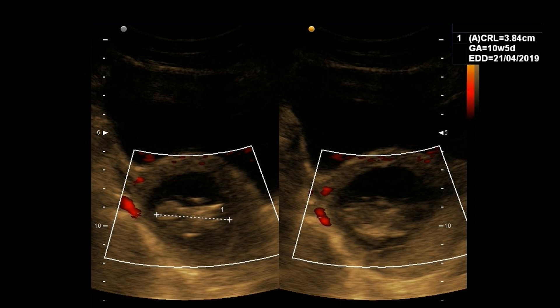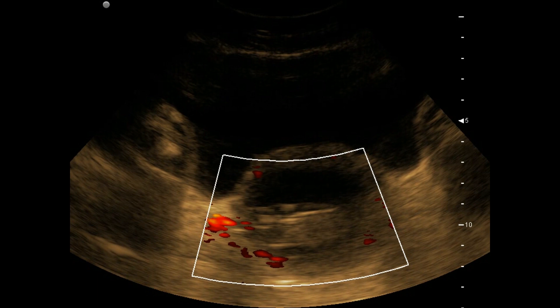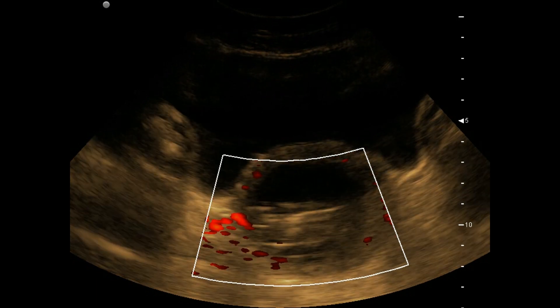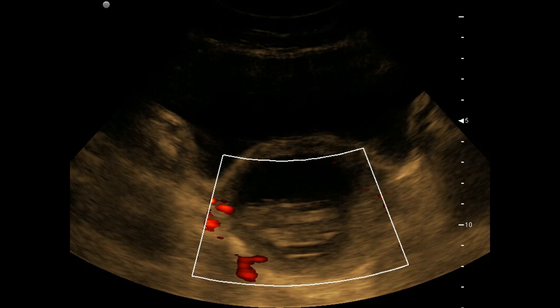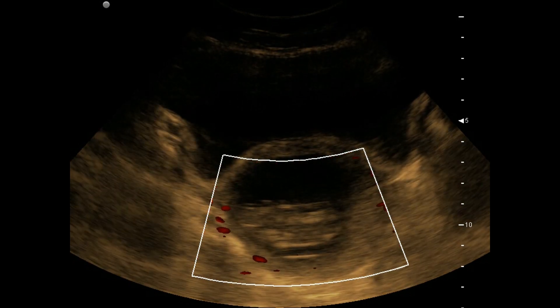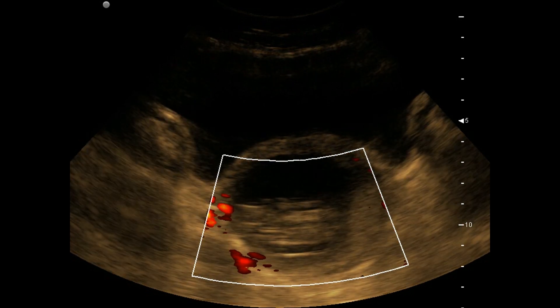We can see an embryo. This sized embryo usually shows good cardiac movements. Here we can't see any cardiac flow using power Doppler. On real-time, no flow is seen within the embryo inside the irregular gestational sac.